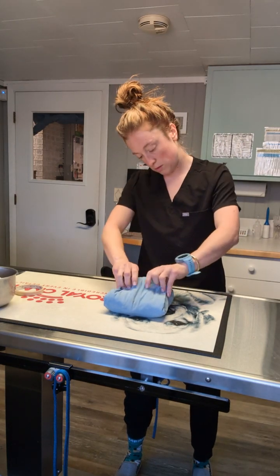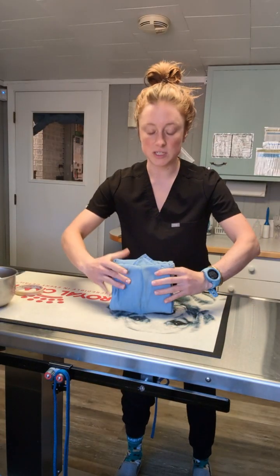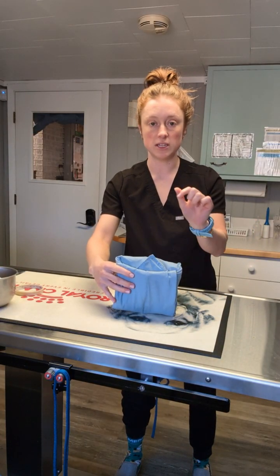Tucking that in, so about an inch sticking out. I don't want the lip sticking out too far from the pack, but it needs to be easily accessible.